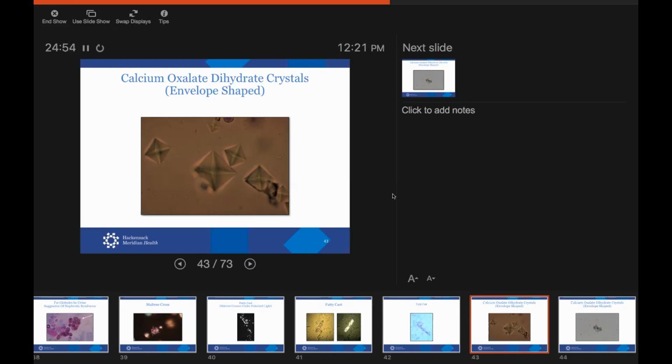You see some stupid reporting here, like you'll see something like 38 white cells per high power field. There's no such thing. There's a grid that you're supposed to report these out on. It's supposed to be less than 1, 1 to 3, 3 to 5, 5 to 10, 10 to 30, 30. There are standards of how real expert labs are supposed to report out urine analyses. So if you go to any hospital that reports out urine analyses just by some haphazard number, you know that the lab doesn't know exactly what they're doing, because it should not be reported that way. I'm just telling you, there's standards to this. For the boards, I guarantee you could look at any board question you want, I dare you, find a question that doesn't report out urines like that. And that's why this is a very important lecture for you guys to not only know how to treat patients, but also get questions right for the boards.